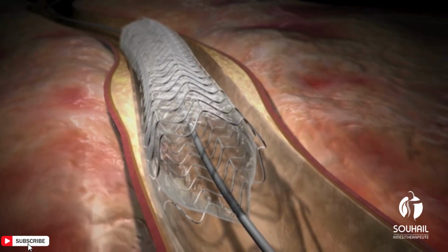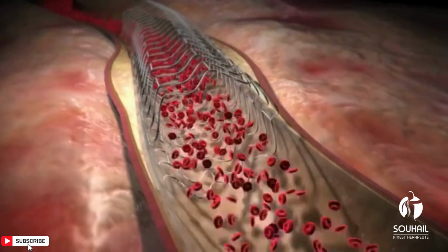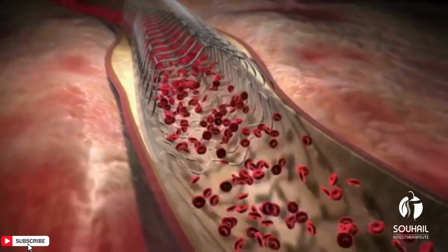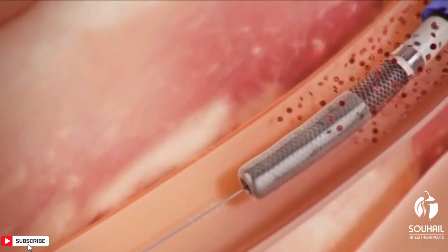Guide wire placement. A guide wire is threaded through the catheter to the site of the blockage. Balloon inflation. A balloon-tipped catheter is positioned at the narrowed or blocked area. The balloon is inflated, compressing the plaque and widening the artery to restore blood flow.